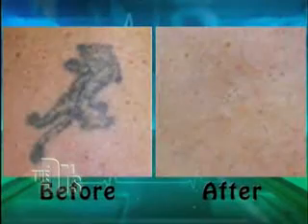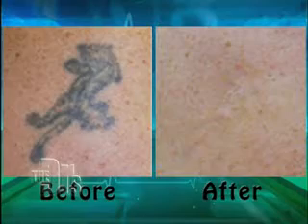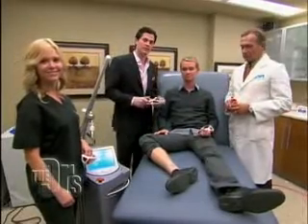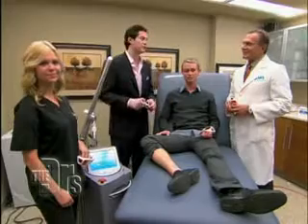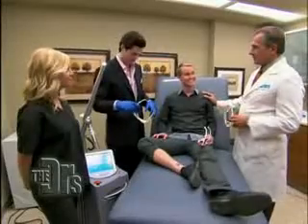That's correct. Your body naturally absorbs the pigment, and it breaks it down the same way it would with any foreign particle. In a tattoo that's untreated, the pigment is really thick and it's sort of coalesced, but your body breaks it down, we fractionate it, we sort of help your body do what it wants to do on its own. Very nice result. I think Josh is going to get a very similar result. Pale skin, dark black ink. He's going to be really pleased in just a few weeks. Awesome. That's what he wanted to hear. Exactly. Okay, great. Josh, are you ready?